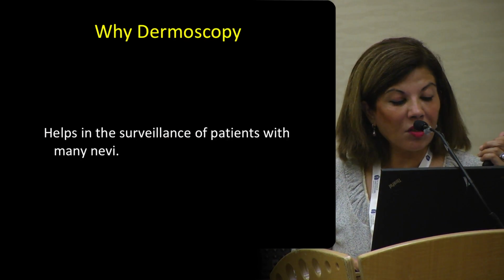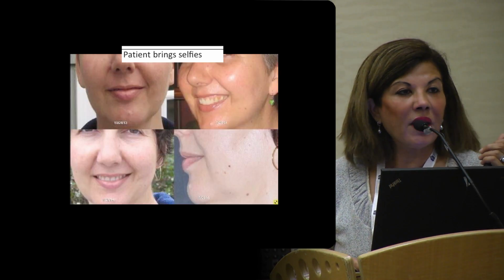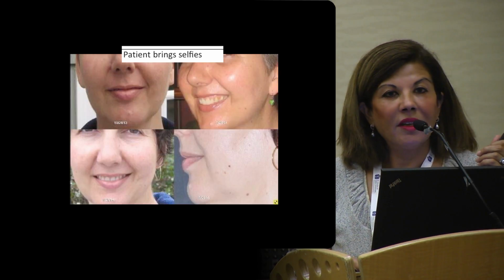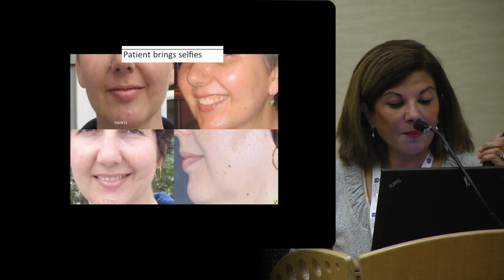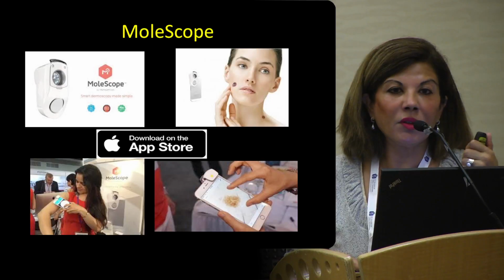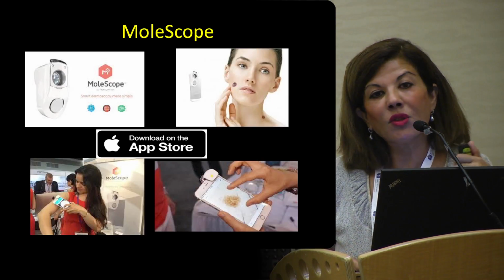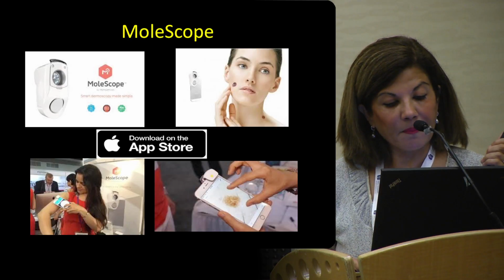And finally, dermoscopy will help in the surveillance of patients with many nevi. And much as we hate patients bringing in their selfies, in dermoscopy we need to encourage this. In fact, there is an app called Molescope that is downloadable on the App Store that allows patients to monitor their own nevi and bring it to our attention if it changes.